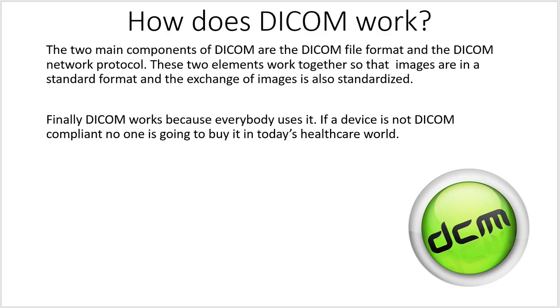Now let's talk about how DICOM works. There are two main components of DICOM, and they are the DICOM file format and the DICOM Network Protocol. These two elements work together so that the images are in a standard format and the exchange of images is also standardized. Finally, DICOM works because everybody uses it. If a device is not DICOM compliant, nobody's going to buy it today.